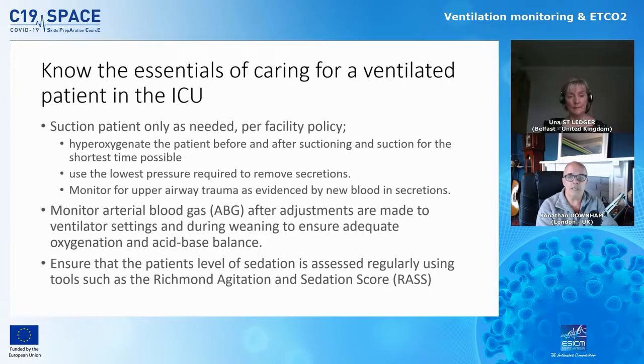Obviously, you want to get down into the lungs and clear those secretions, but once you feel that you're far enough in, then pull that suction tube out, especially as the patient starts to wake up. If you hit the carina, the division between the right and left main bronchus, that will make the patient cough very hard, and it's very uncomfortable for them. So do it for the shortest period of time possible. Use the lowest pressure you can.